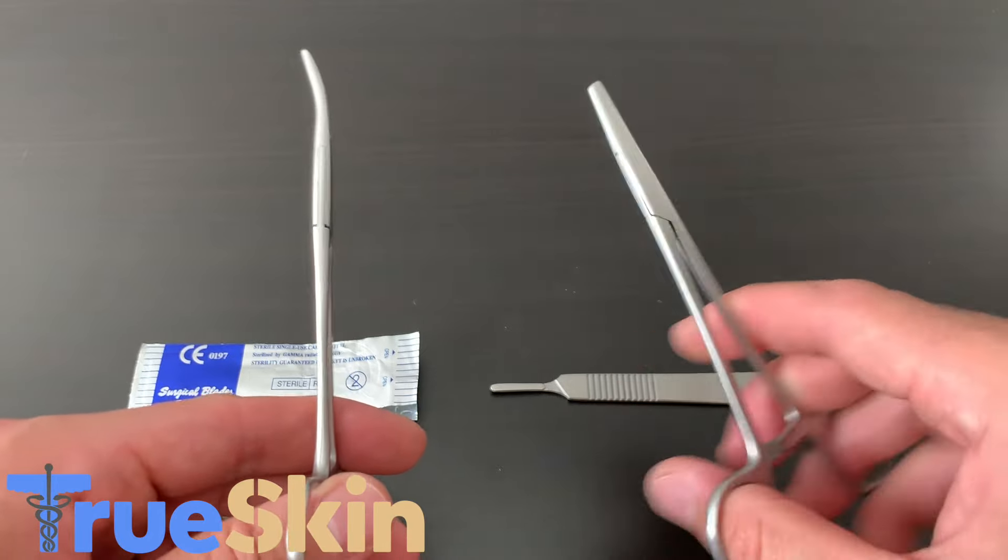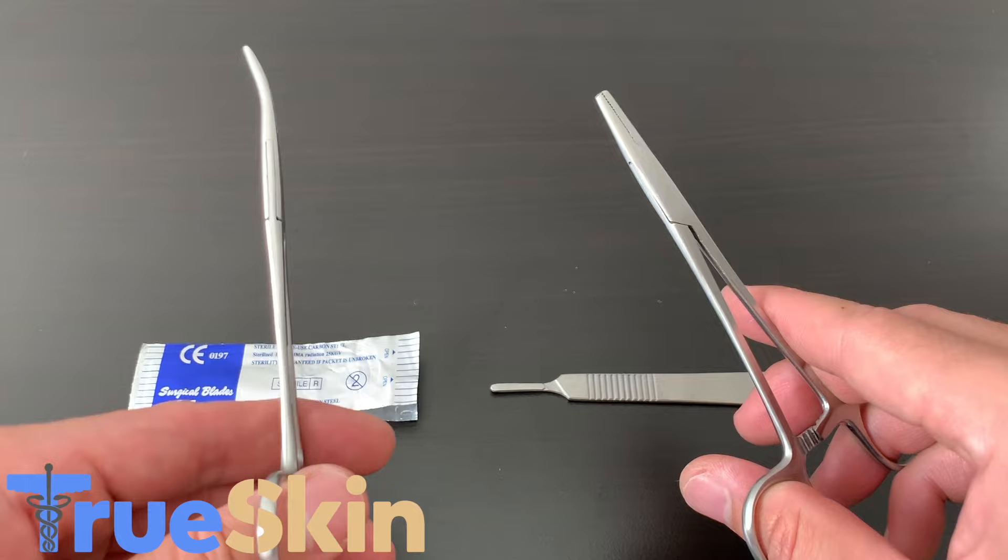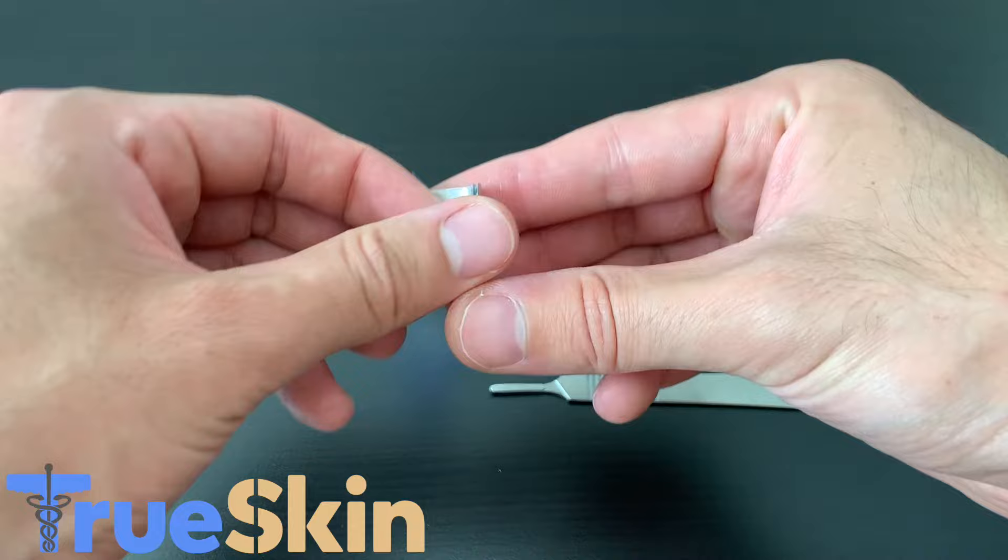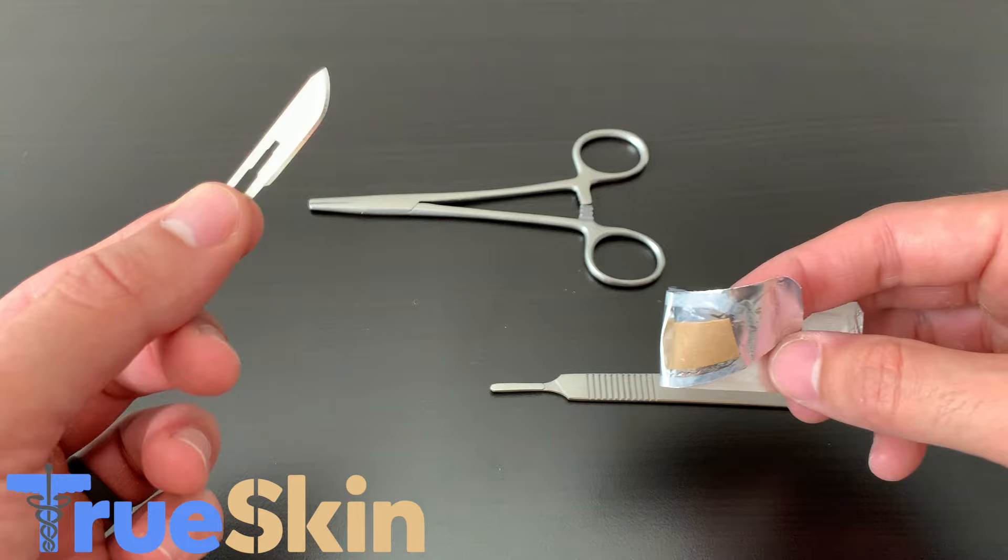To install the scalpel, grab your needle holders. That's different than the curved hemostats—those will not grab the blade as well, so we'll put those away. Start by opening up the scalpel package and take out the blade.